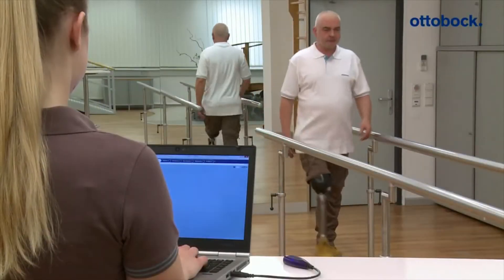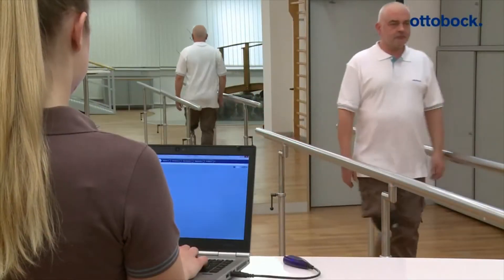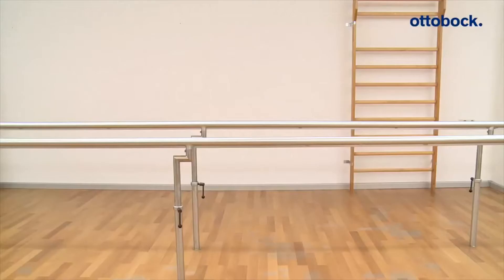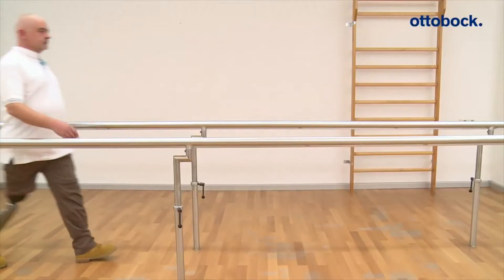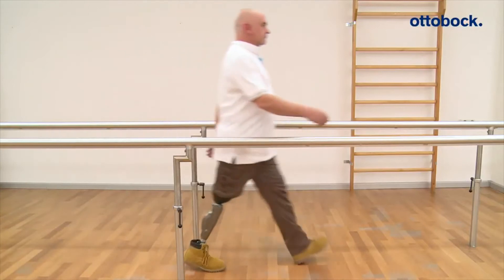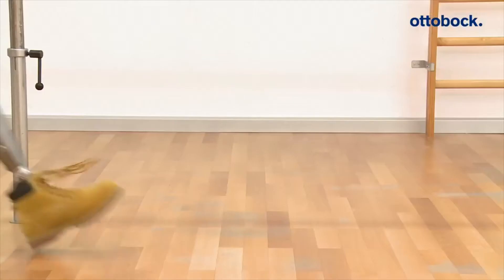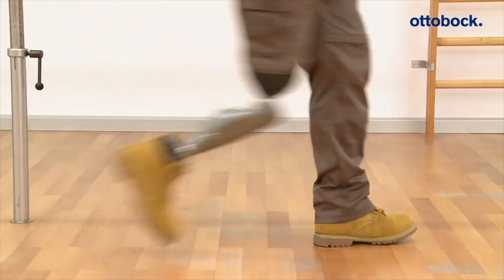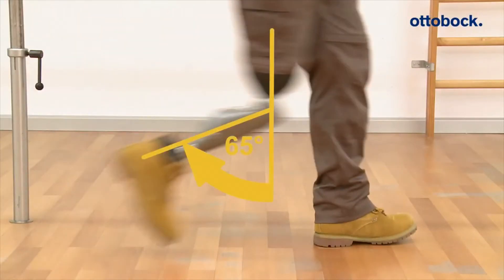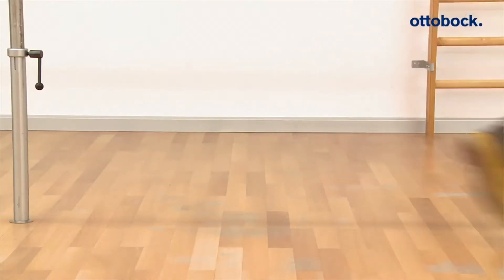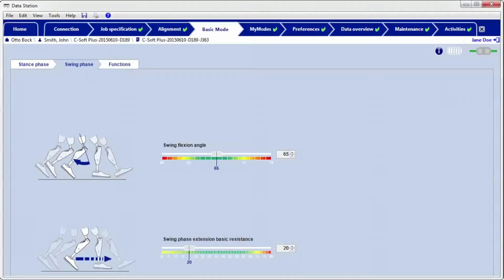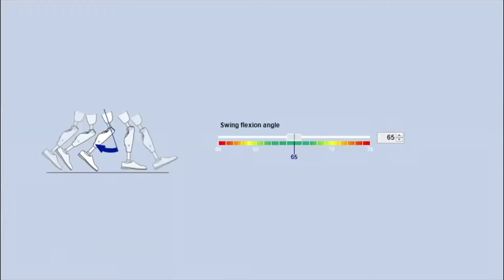The swing flexion angle describes the angle at which the knee starts to extend again. For a physiological gait it is approximately 65 degrees, regardless of the walking speed. 65 degrees is the standard value in the software. It can be adjusted individually for the patient.